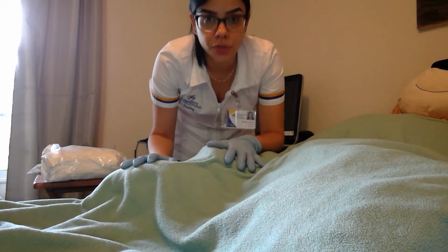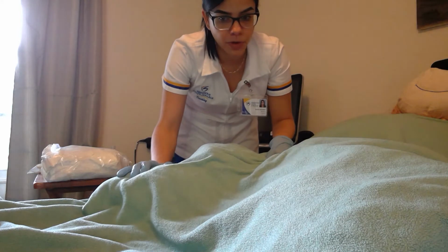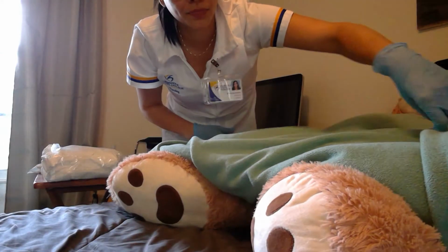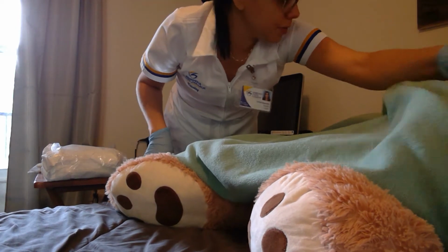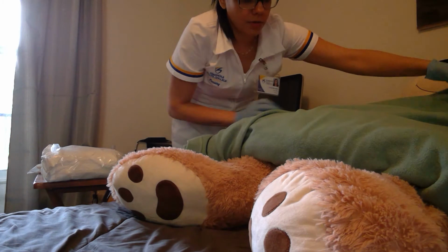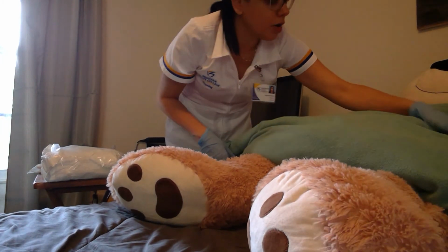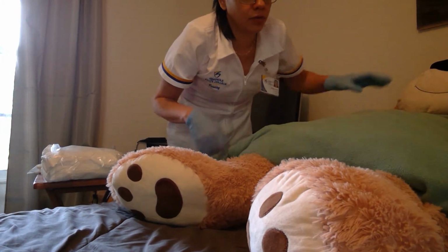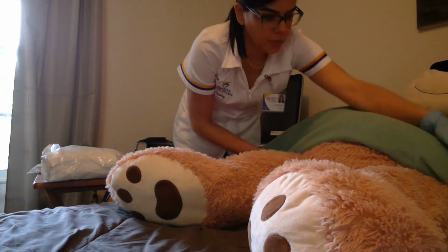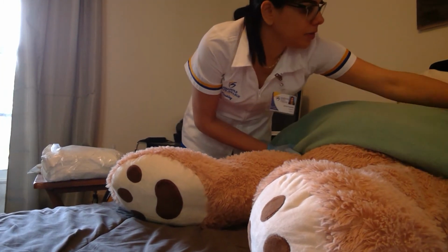And now I'm going to expose her, and I don't want to expose her more than what she needs to. So I'm gonna come from here, and I am going to expose you now, Miss Pawlowski, okay? I'm gonna fold it like this, and I just want her upper body to be covered, only exposing from the waist down. There we go. Okay, I want you to be relaxed.